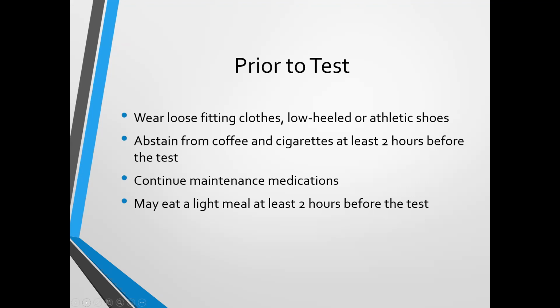They want to keep it as straightforward as possible, without other substances interfering. Continuous maintenance medication: if the patient takes Advair Diskus every morning, they should continue to take it. Rescue medications, if they need them, they should obviously take them, but they should not take them prophylactically. They may eat a light meal at least 2 hours in advance.